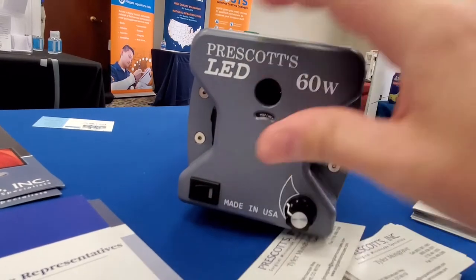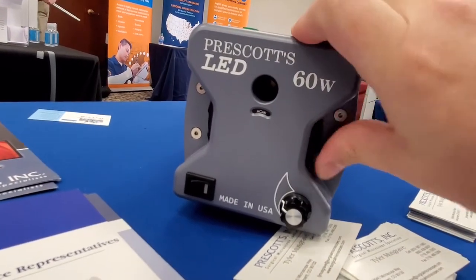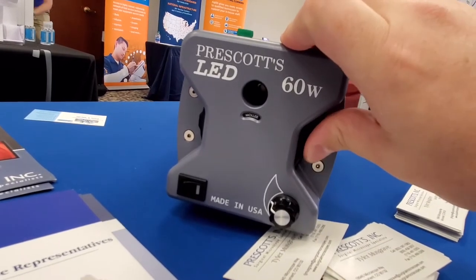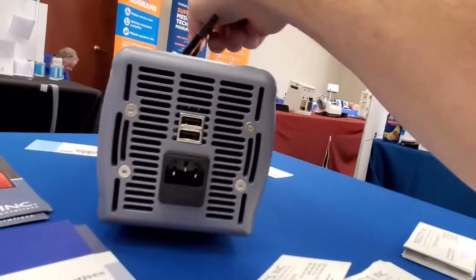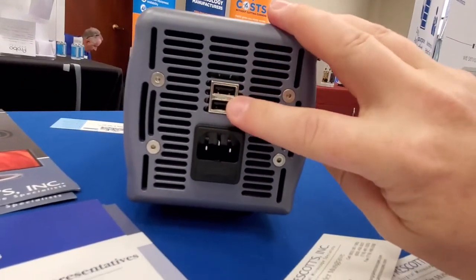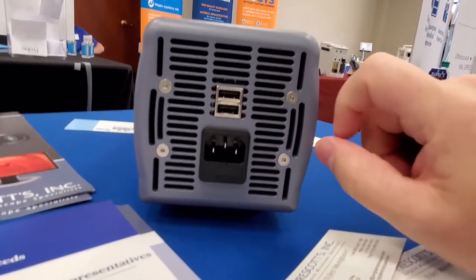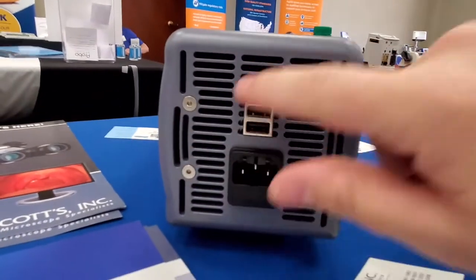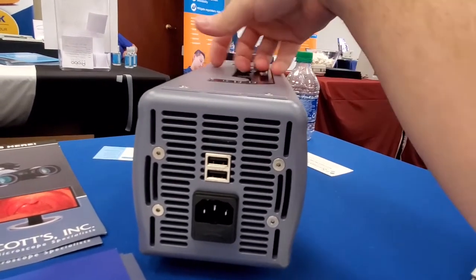Right here is the dimmer, and here's the power. It's even got some options labeled right on the front, so it's got a variety of different options. On the backside, it's got USB for charging and a standard IEC power input.